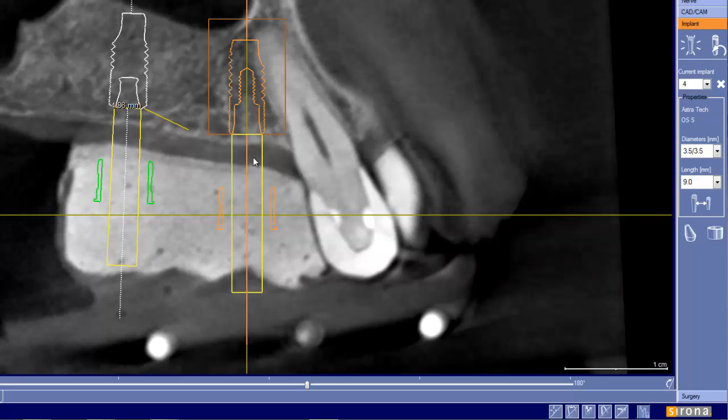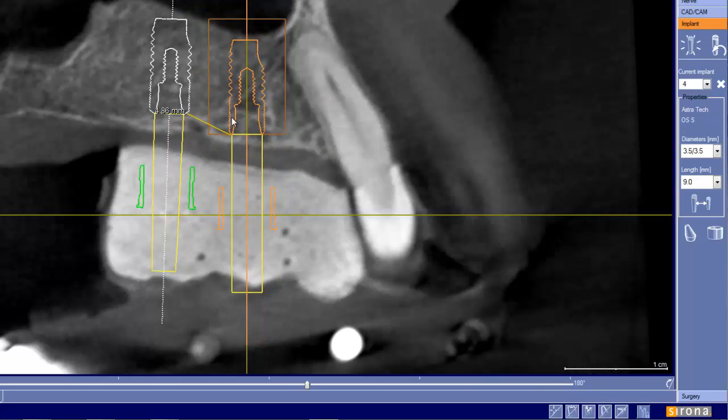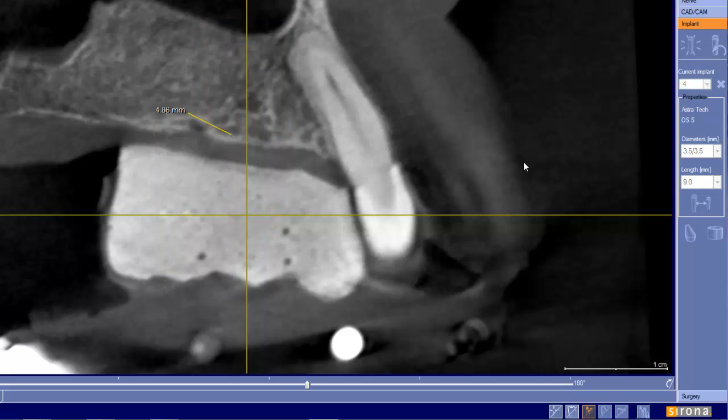But now what do we have to deal with? A vital structure. So this may be a case where we have to purposely place this implant right here and do an anterior cantilever, because we're trying to avoid this. Now oftentimes people will say, well, why is that the case? And again, my drawing skills aren't the best, but if we were to place these teeth back in here, I would bet money that these roots were curved for these teeth, as so.